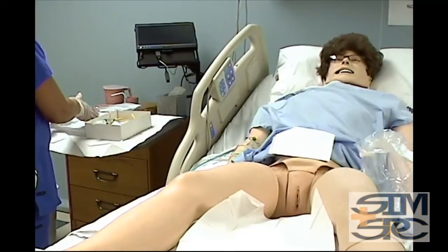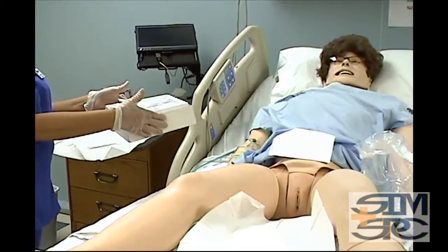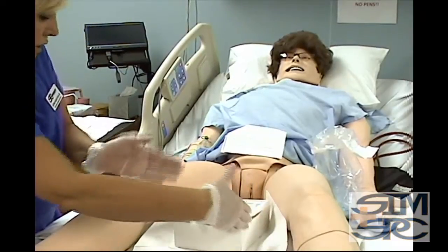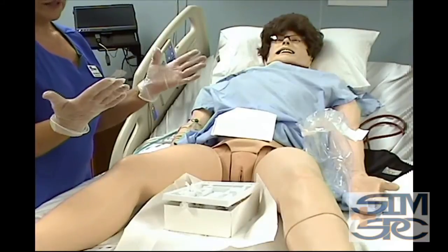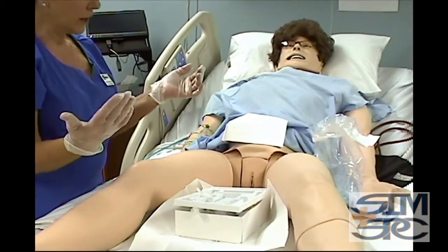Okay, now you're going to take the top part of the tray and set it on the bottom. Then we're going to move it over to the center. You don't want to touch the arms or the legs. You're going to have to remember that one hand will be considered contaminated. And if you're right-handed like me, then you're going to insert with the right hand.